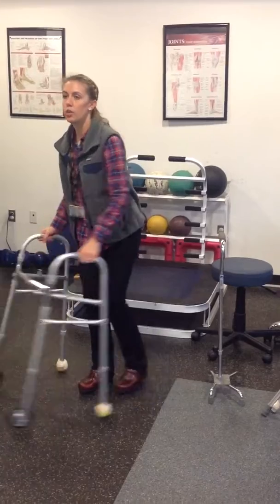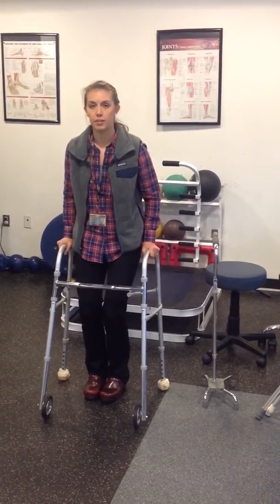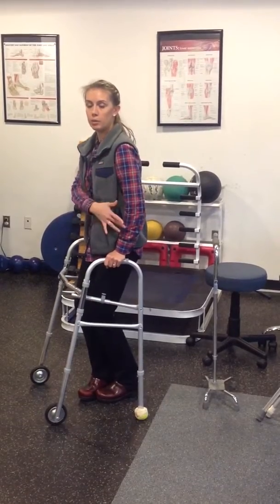And the same position for a walker, where you want just both hands right at your hip joint with about that 10 to 15 degree bend in your elbow.